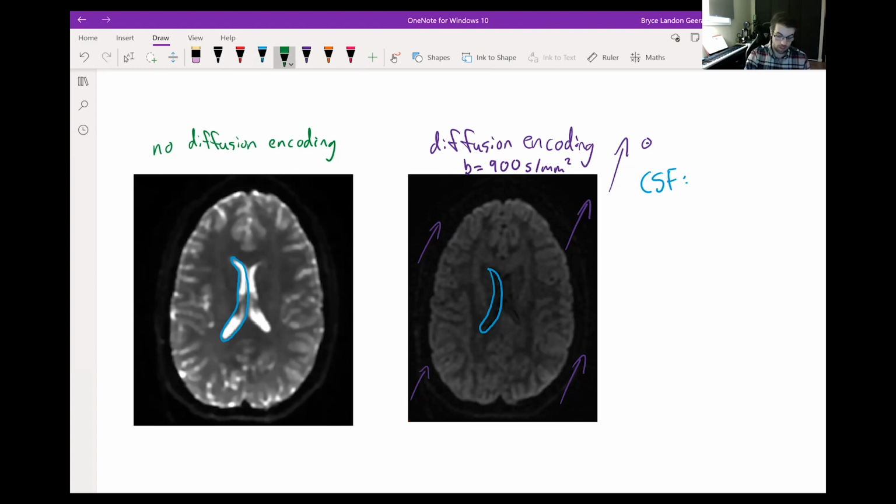The reason, okay, let me start writing stuff out here. So in our T2 weighted image, which I've got in green here, the ventricle is bright. And then in the diffusion coded image, the ventricle is very dark. This is because there is nothing standing in the way, aside from the sides of the ventricle itself. There's nothing standing in the way of water molecules just moving away, just going off to do their own thing during that diffusion time, the time between the encoding and the reversal gradients. So signal in CSF is lost quite quickly because water is free to move, and move it does.